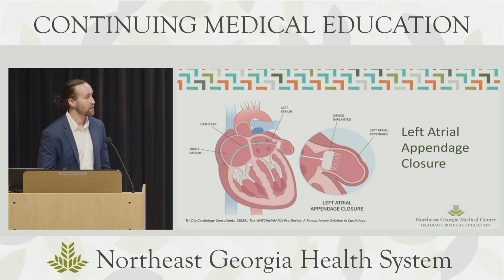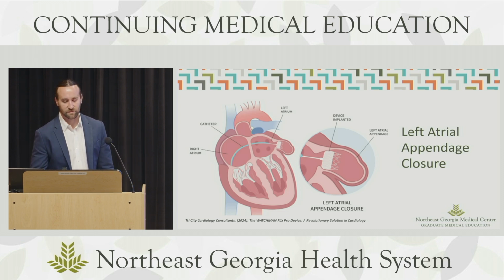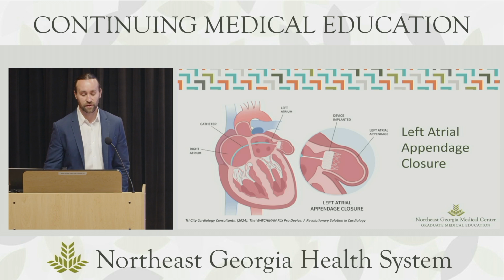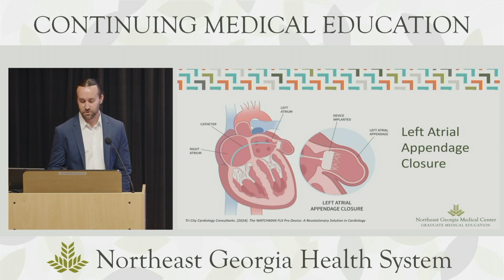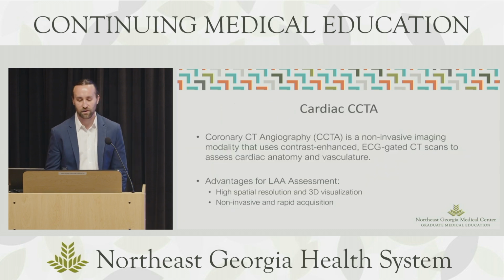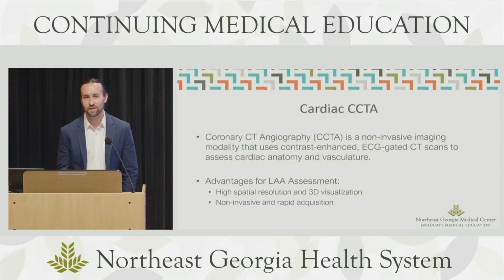Just talking about the procedure, nowadays it's a very benign procedure. It's an outpatient same-day procedure. We put a catheter in the femoral vein in your groin, run a catheter up to the heart, cross from the right to the left side of the heart, and we put this little occluder device, as you can tell, in the left atrial appendage and seal it off, hopefully decreasing your risk for stroke for those patients that can't tolerate anticoagulation. So how does cardiac CT play a role in this?